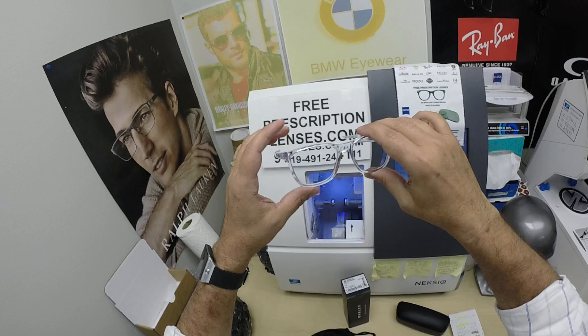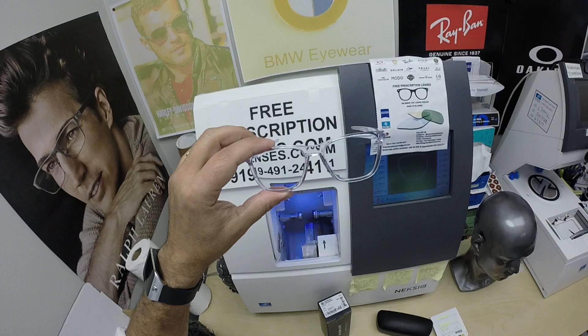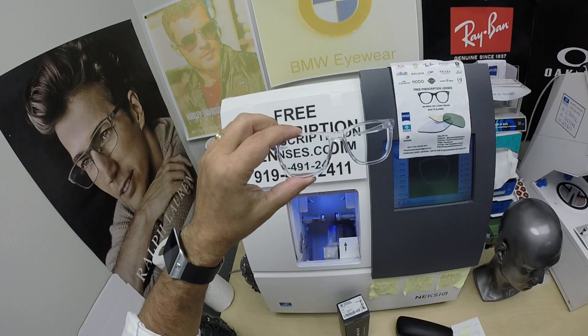The frame comes with the Oakley hard shell case, the Oakley cleaning cloth slash carrying bag, the original demo lenses that came out of the frame, and of course this is the star of the show — the main attraction — what's going to be shipped to David's house in Brick, New Jersey.